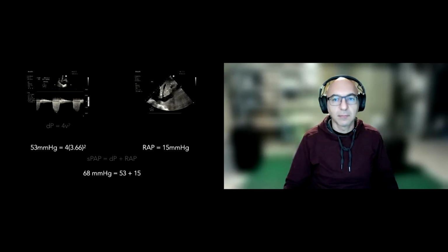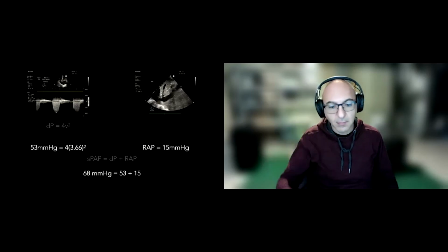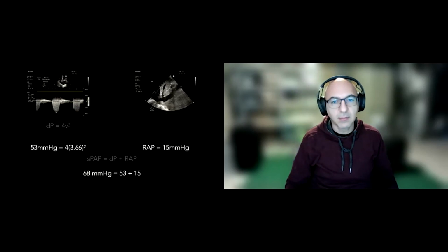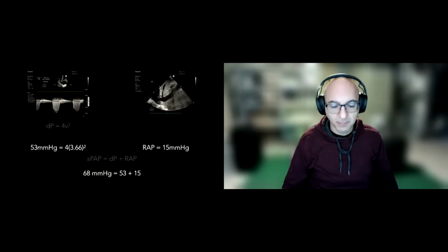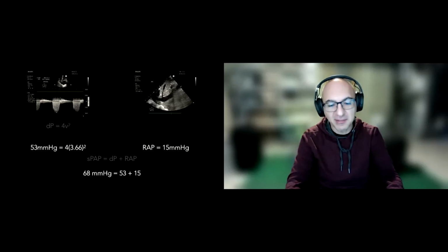And I don't know, Z, do you want to weigh in a little bit more, kind of nuance that a little bit more? The numbers I have in my head are 25 and 40. Am I correct in that, or is there other numbers that you need to think about? Yeah, I think these numbers are really good. Of course, if it's 23 or 25, it's not going to make a big difference. But 25 and 40 is really a good ballpark for the numbers.